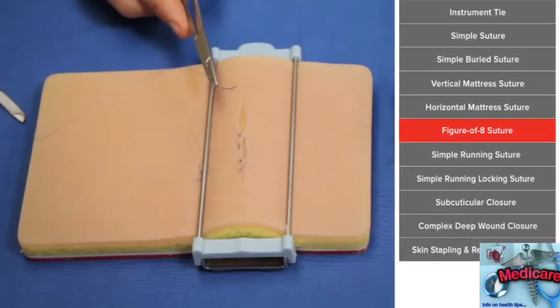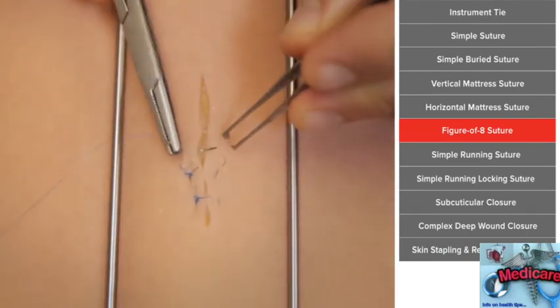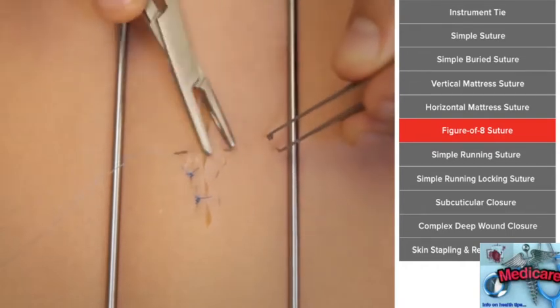Another variant of the horizontal mattress is called a figure of eight suture. We'll often use this in general surgery where we have big wounds that are gaping apart, or fascia, and we need strength. It's placed in the same way.